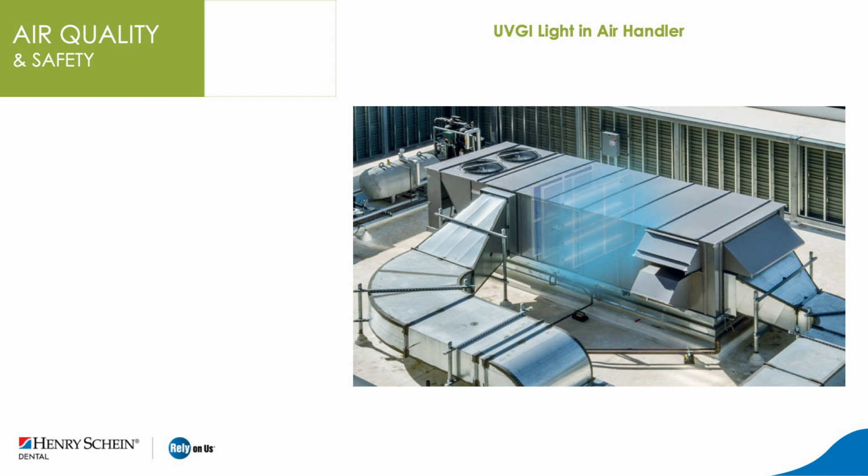And when we're using a HEPA filter, UV light is somewhat redundant in our armamentarium of being able to recondition the recirculated air. But if you're going to use UV light, you want to use UVGI light, because this particular wavelength is indeed germicidal for all viral and bacterial particulates.